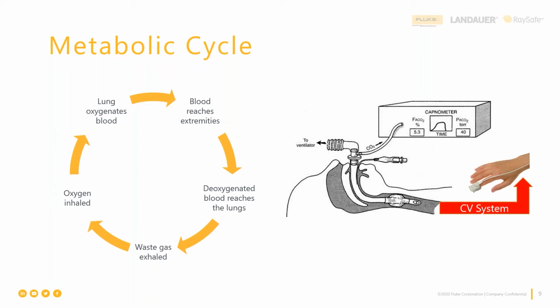So when we're worried about supporting healthy breathing in the patient, we want to know both sides of this. The oxygen side, for oxygen coming in to each cell in the body, especially those at the far distant points in the body: fingers, toes, heads, and nose. And we also want to know how much carbon dioxide is being exhaled. That's called gas exchange, and the goal of proper gas exchange is to get oxygen maximally in and carbon dioxide out. So what we don't want to see is any inhaled carbon dioxide. We want to see it all going out.